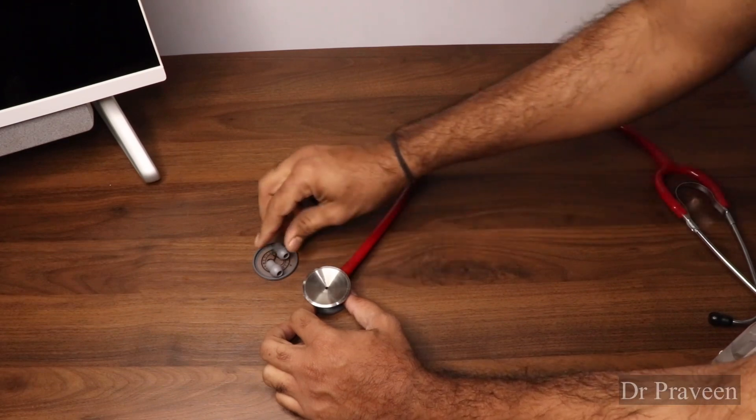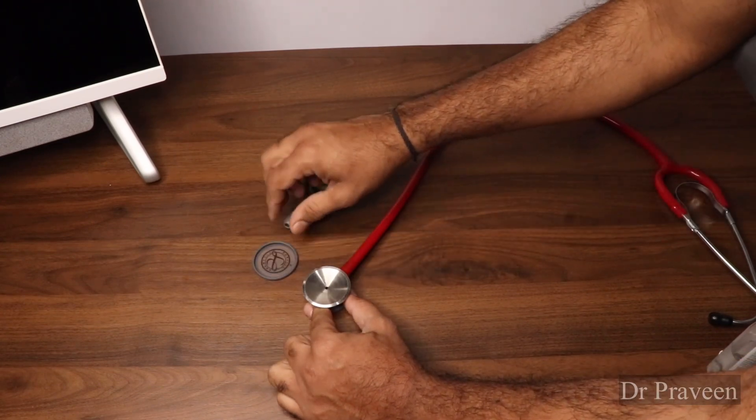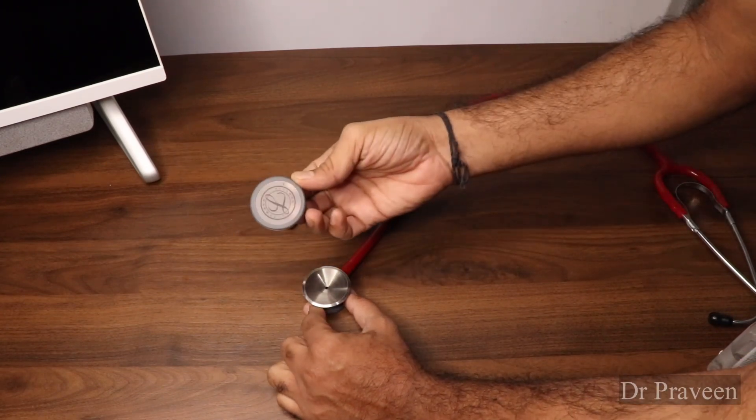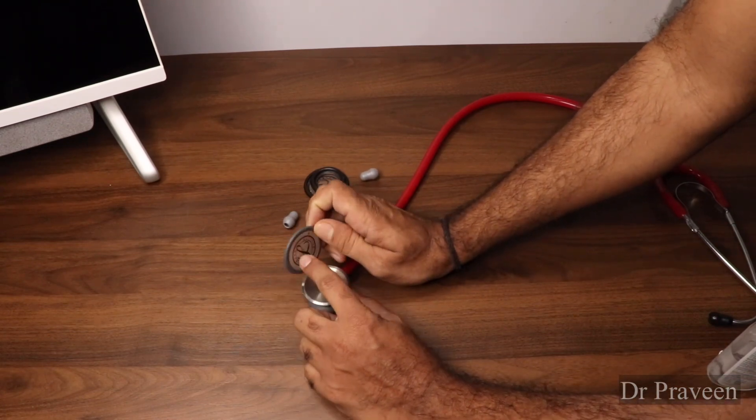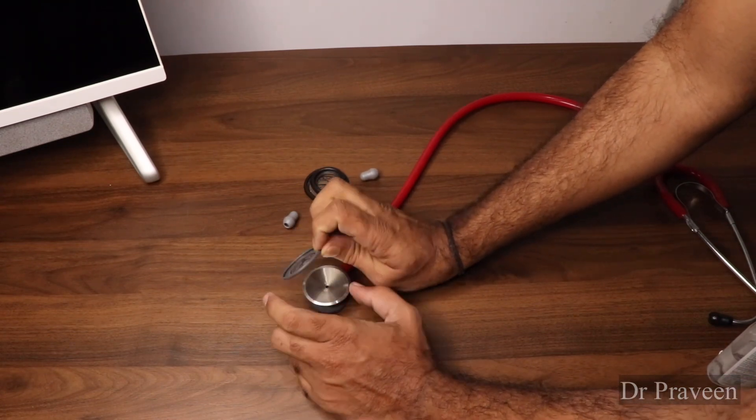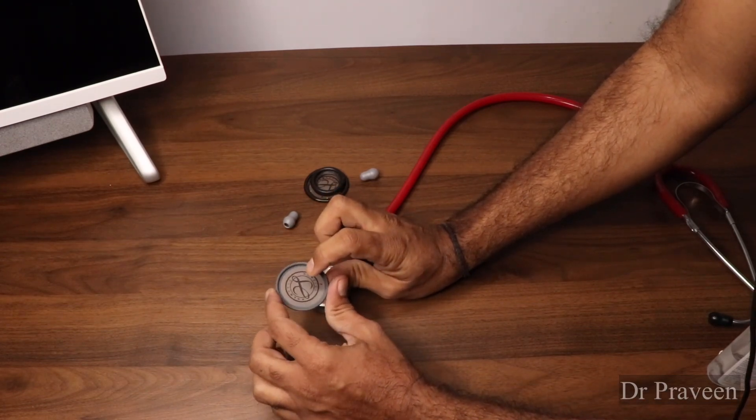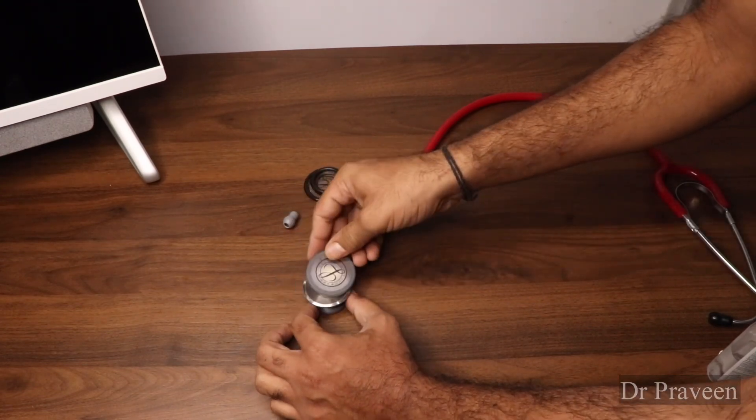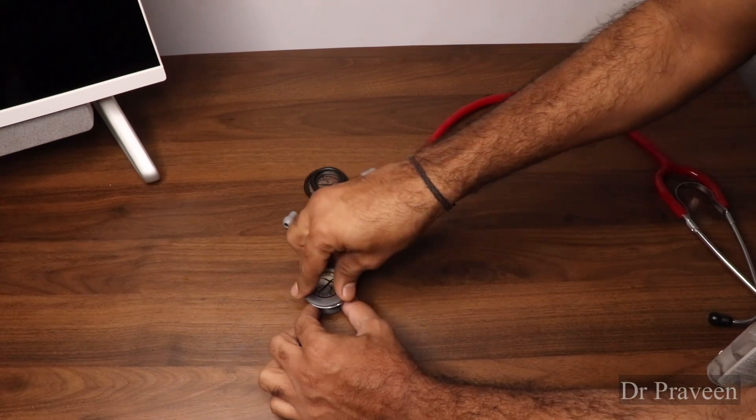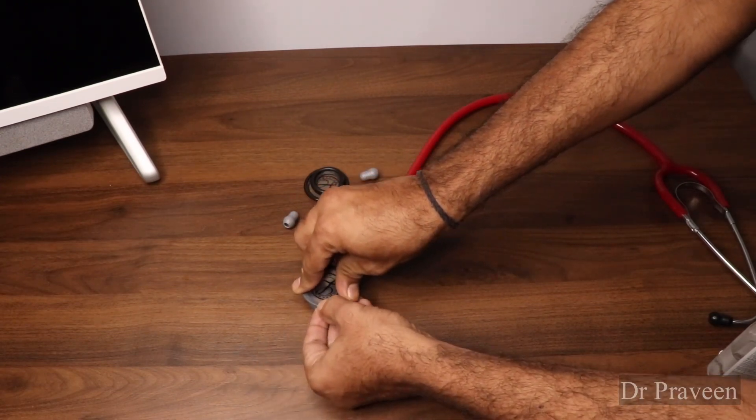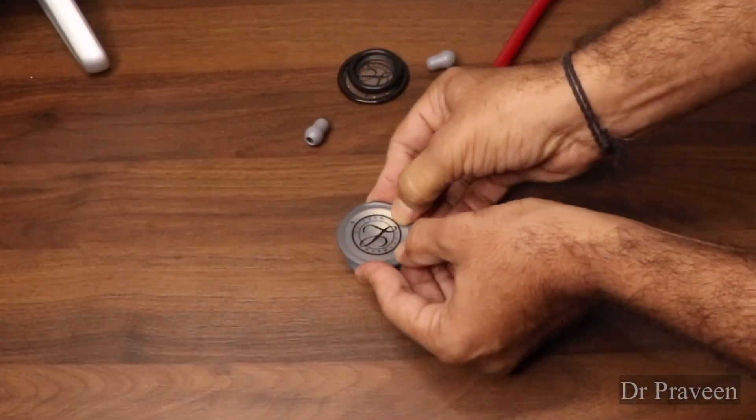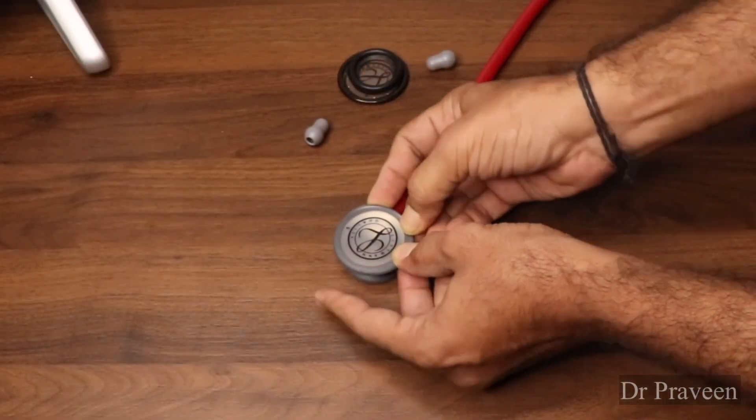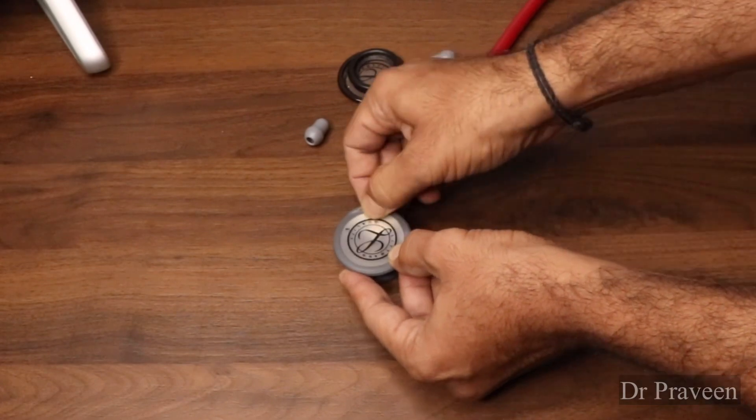Coming to this direction. Sometimes this outer ring and chest piece comes differently, so you need to just adjust it. In this piece it has come together, so you have to fix it.